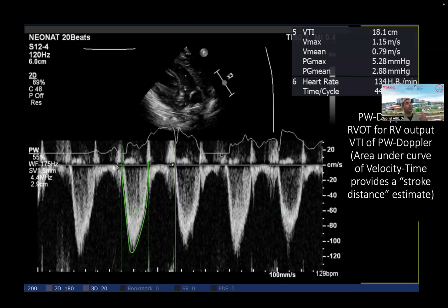Third, typically the lung that's affected on the X-ray will look completely black because you have no pulmonary blood flow. So that's another indirect sign that you might not see by echo. We often see that with CDH. With a left CDH, you'll see a hypoplastic, tiny left pulmonary artery. There's not much you can do about that, but you'll see that the flow is much more restricted.